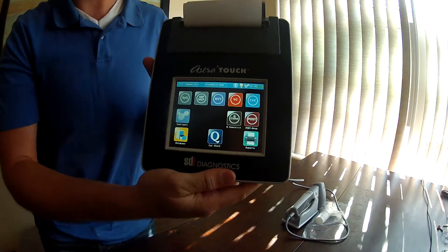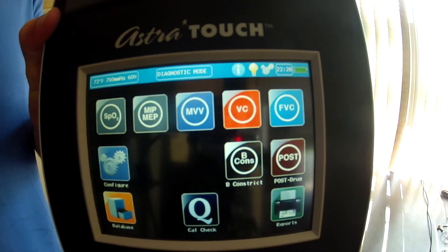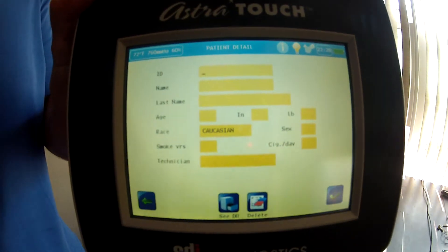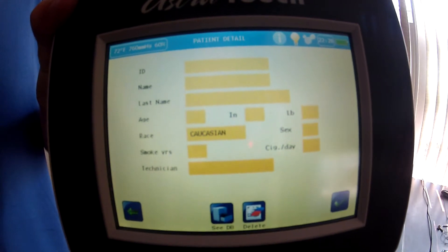Here it starts off with this screen — I want to bring it up closer so you can see. You're going to have a variety of options here, but I'm going to demo the FVC option. It's going to come up with a list of questions that you need to fill out for it to calculate its predicted sets.